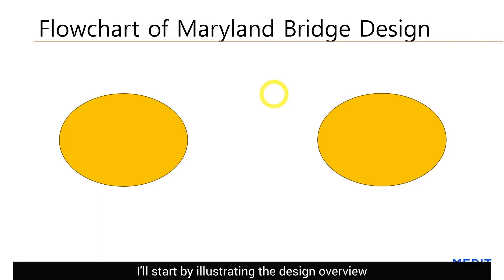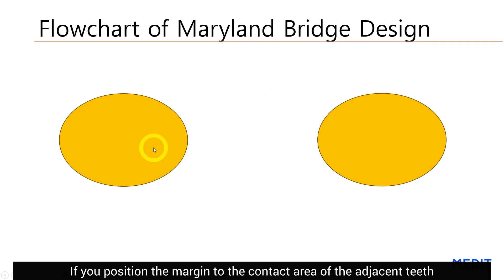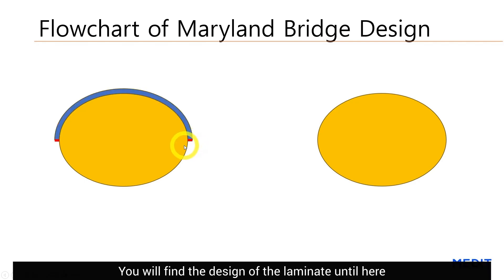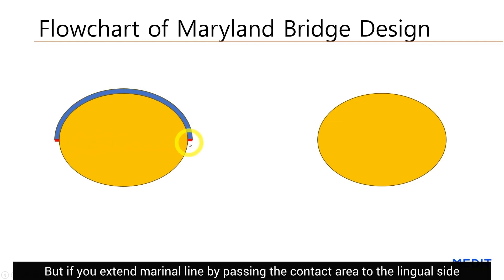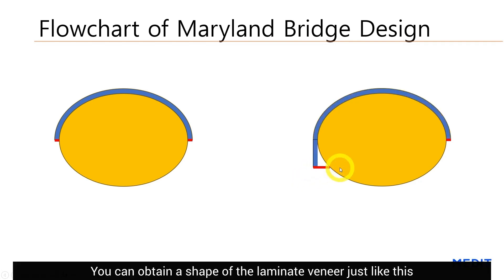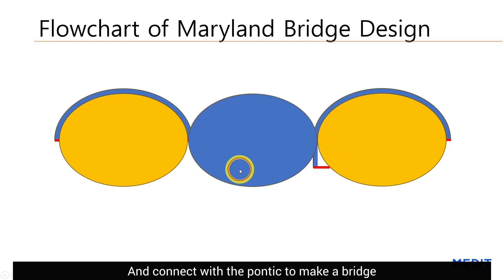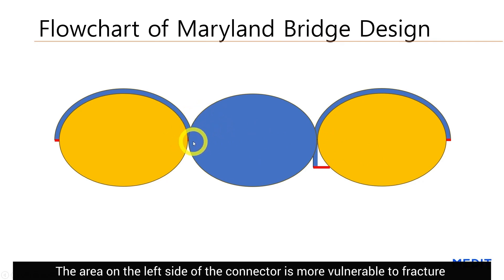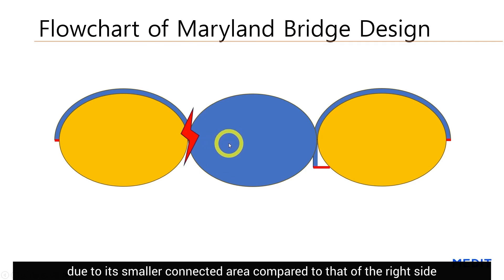I will start by illustrating the design overview. If you position the margin to the contact area of the adjacent piece, you will find the design of the laminate until here. But if you extend the marginal line by passing the contact area to the lingual side, you can obtain a shape of the laminate just like this, and connect with the pontic to make a bridge. The area on the left side of the connector is more vulnerable to fracture due to its smaller connected area compared to that on the right side.